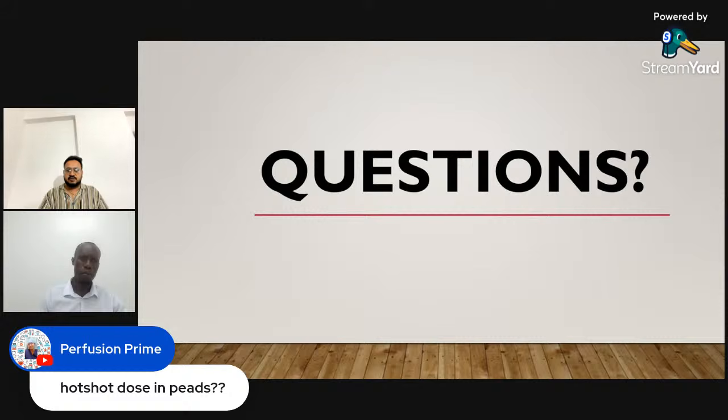So the last question we have: hot shot. Yes, we give hot shots. We give hot shot dosage. How much dose do you give? How much hot shot do you give? I can go about 10 mils per kg.